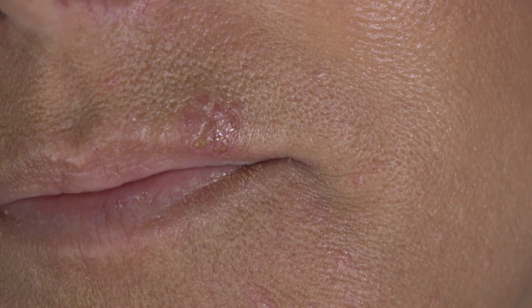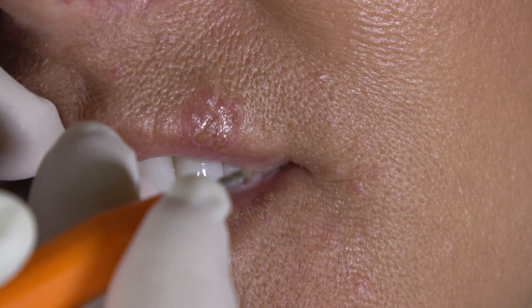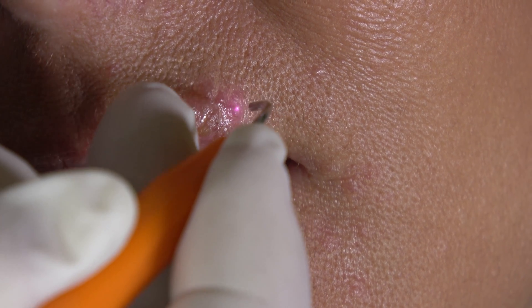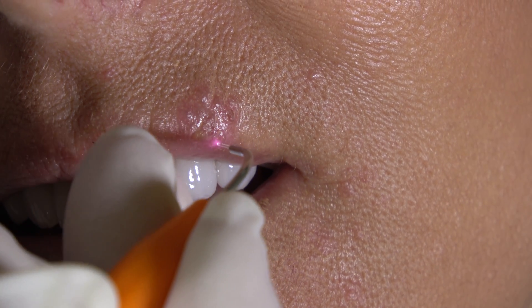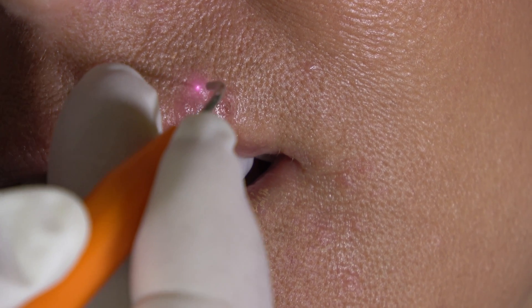That's 30 seconds. Now I'm going to bump it up an additional tenth of a watt — now I'm at 0.6. Let me know if it gets too uncomfortable.